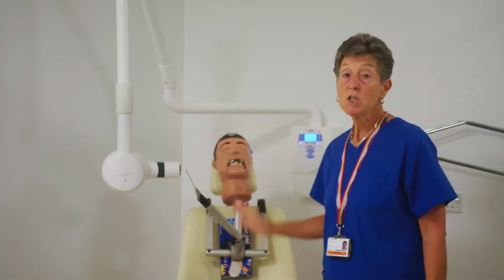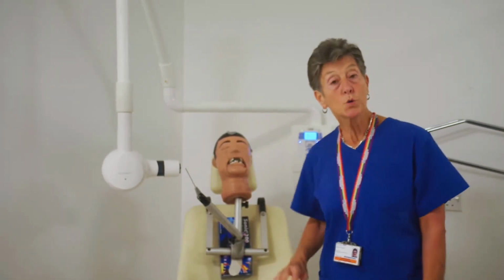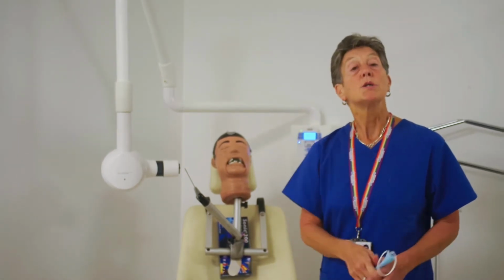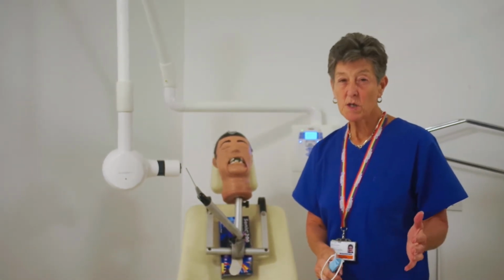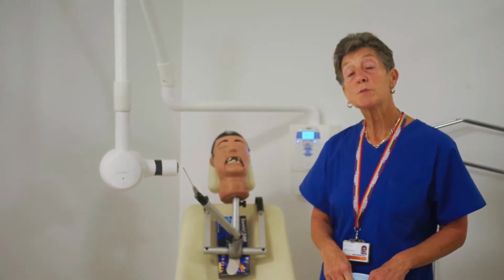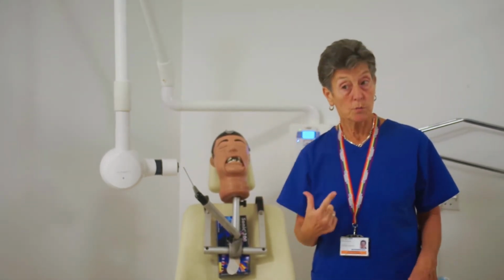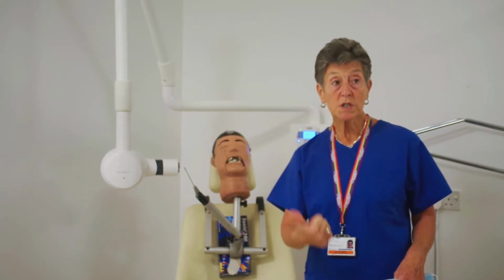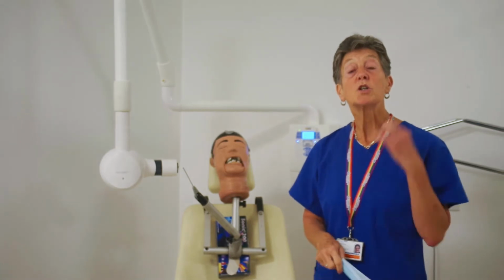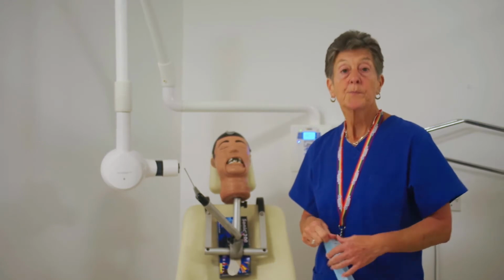One is make sure you've got the correct patient in your chair. So you need to check date of birth, you need to check name, you should check address, but sometimes that's quite difficult to do. We also need to make sure that the patient is properly prepared, so earrings, necklaces, if you're doing extra orals, false teeth, a brace, anything inside the mouth that can be removed before that could obscure the area that you would like to look at.